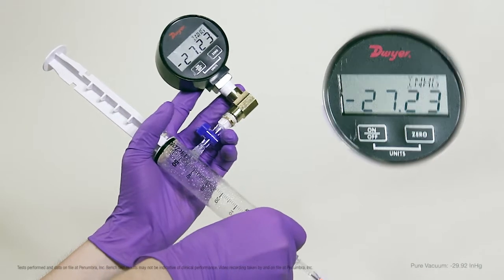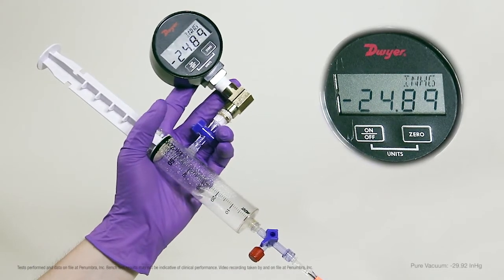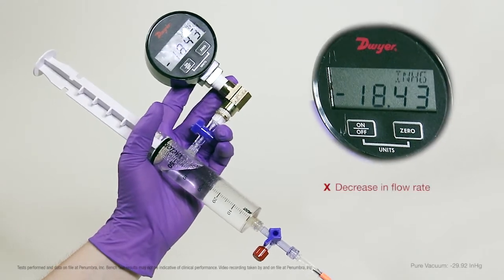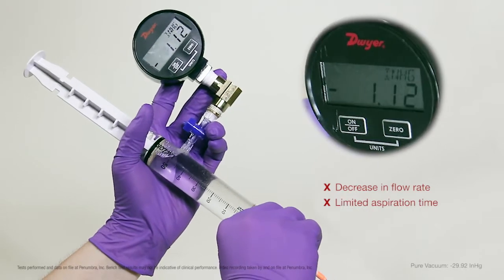We now open the stopcock on the syringe, allowing water to enter the syringe through the manual aspiration catheter. As the syringe fills with water, we see a decrease in vacuum, which causes a decrease in flow rate and a subsequent limit in aspiration time.